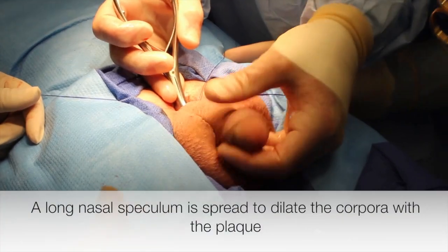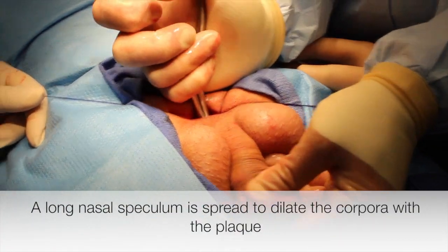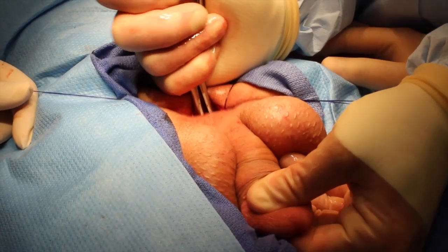An 80mm long nasal speculum is then passed down the corpora in order to dilate it. Note that once the speculum is opened, the plaque is fractured along the x-axis.